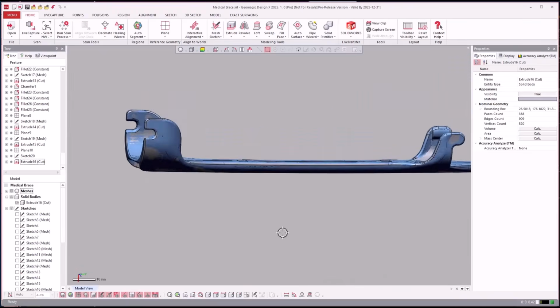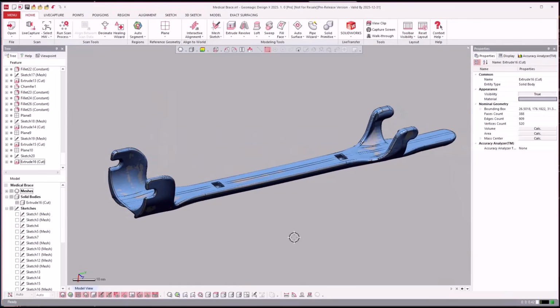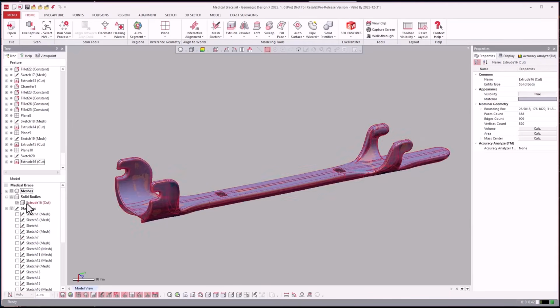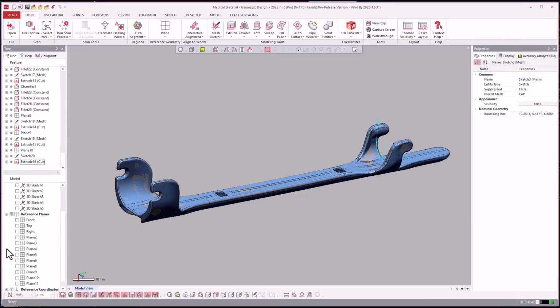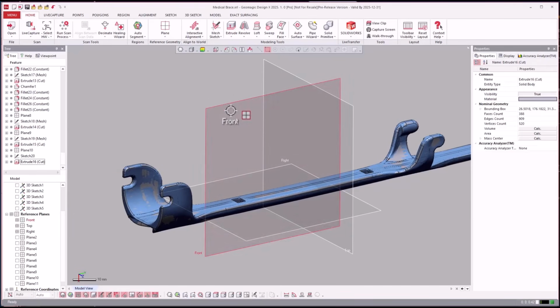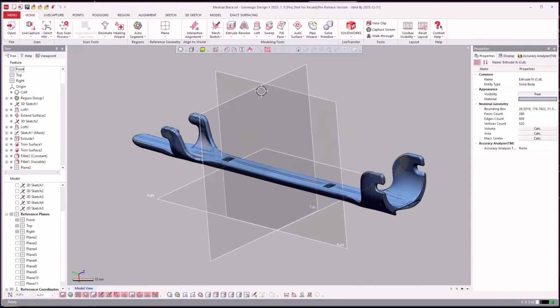So there is a surface modeling example. Now there were a few different things that happened in here that were really interesting that I wanted to highlight. One of them is when you're doing sketches, we'll just go ahead and open up, collapse this and turn on my planes.